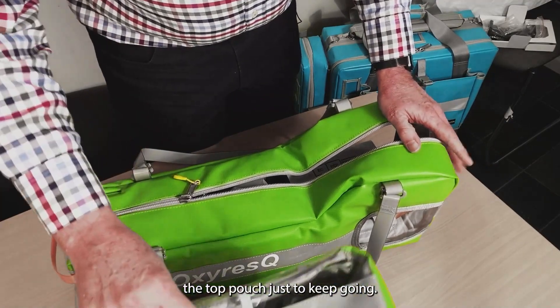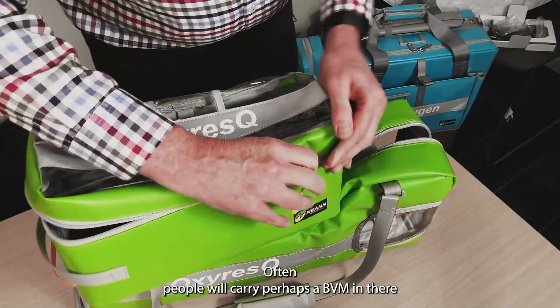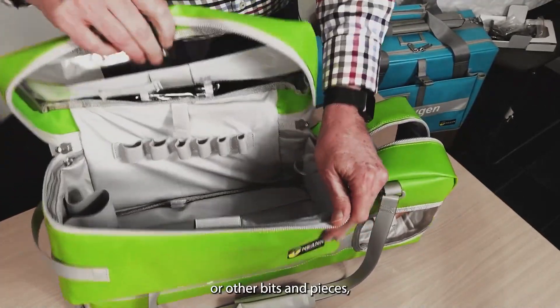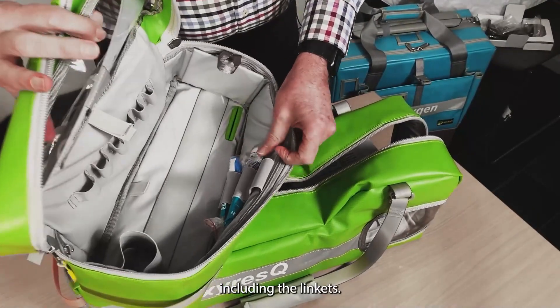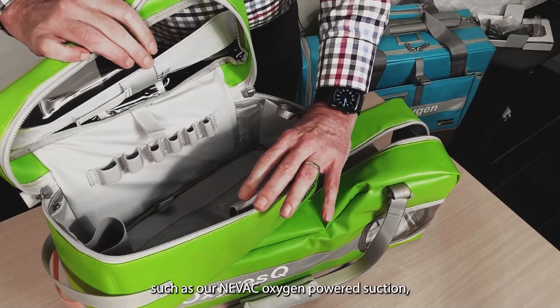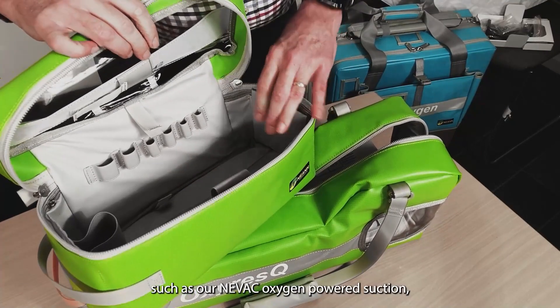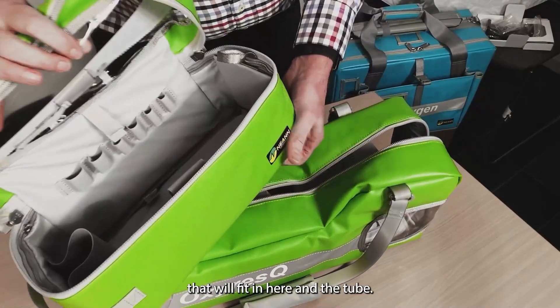The top pouch — often people will carry a BVM in there, or other bits and pieces including Laerdal pocket masks. If you have a suction device such as our NEVAC oxygen-powered suction, that will fit in here along with the tube.